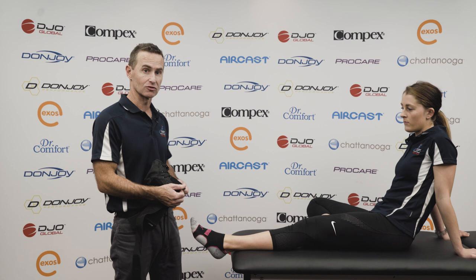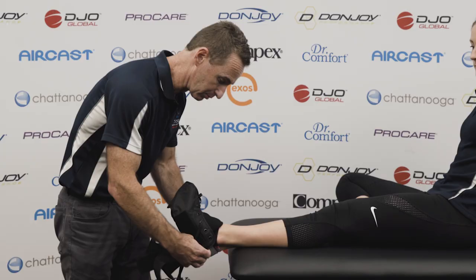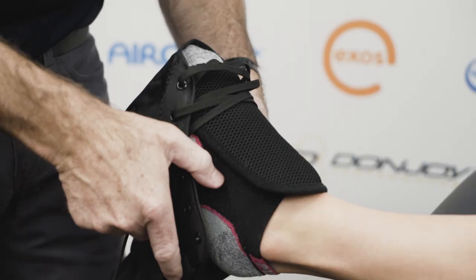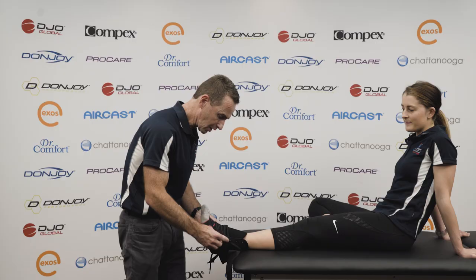Applying the Donjoy Sports Ankle brace is quite easy — certainly a lot easier than trying to tape yourself. Best to have a sock underneath the brace. All we do to begin is place the brace on and pull it up until it's all the way over the heel.